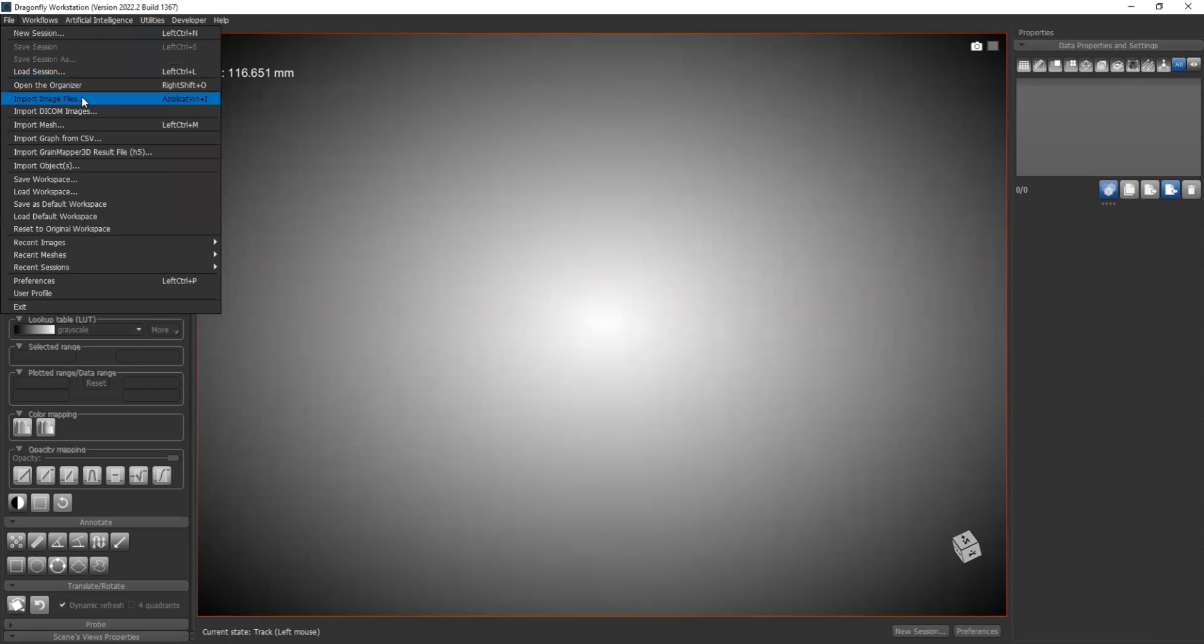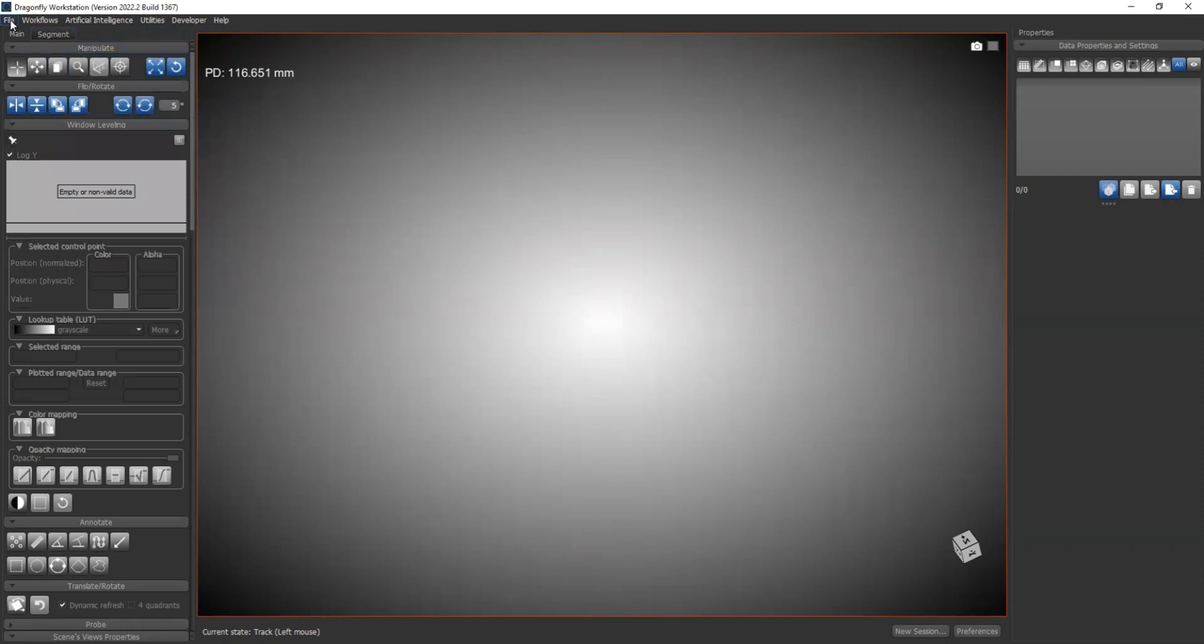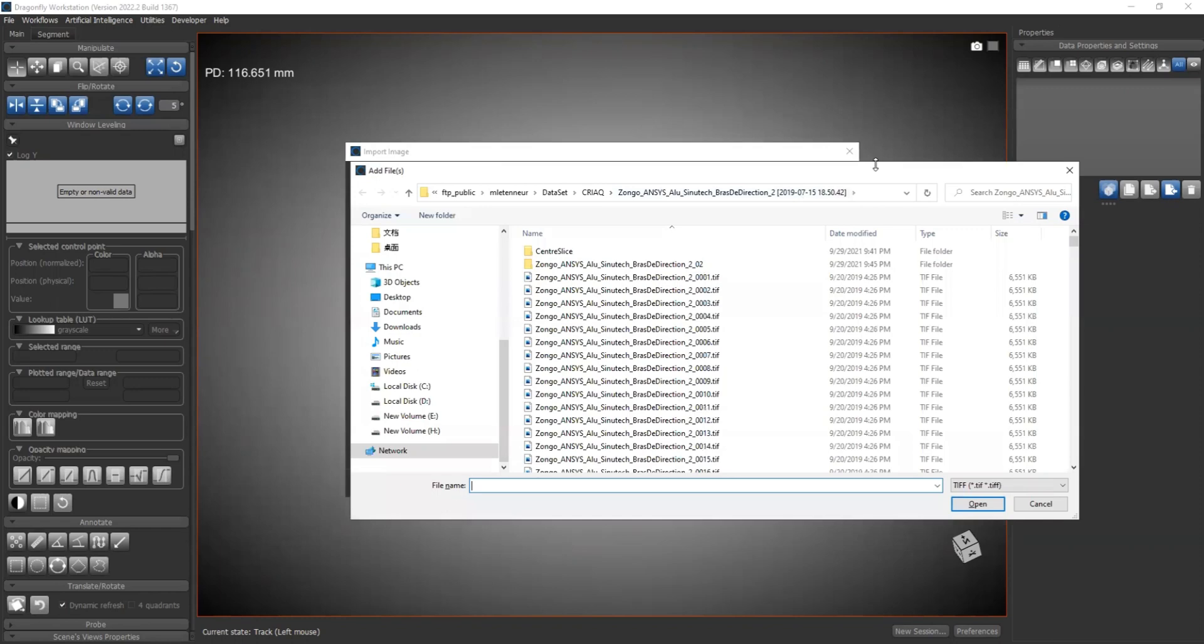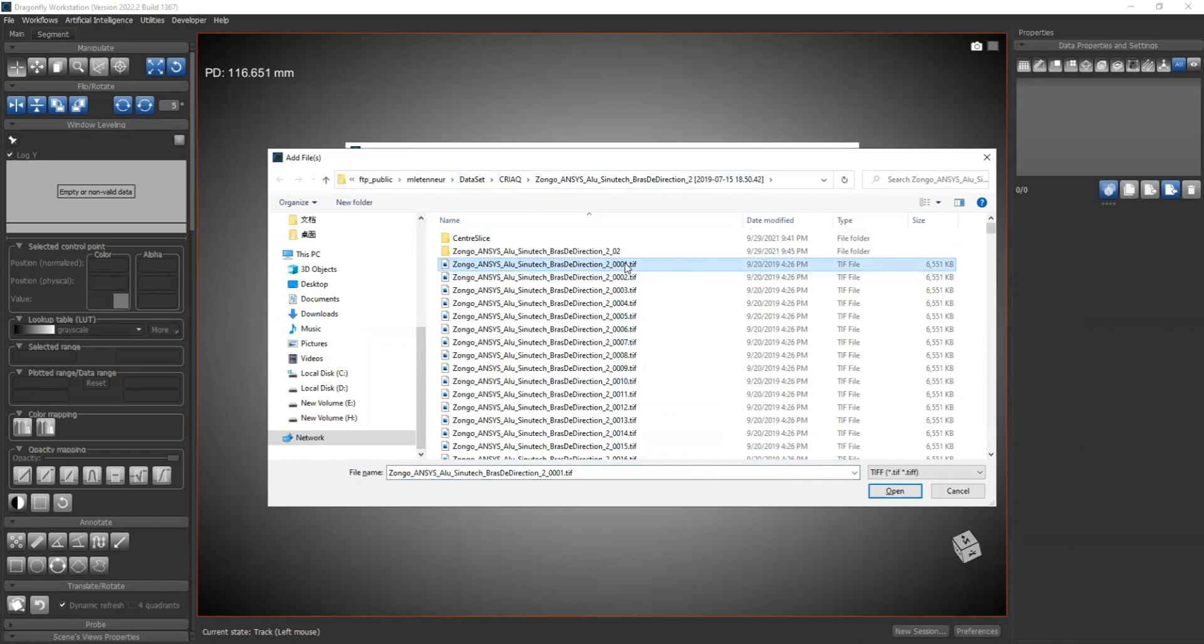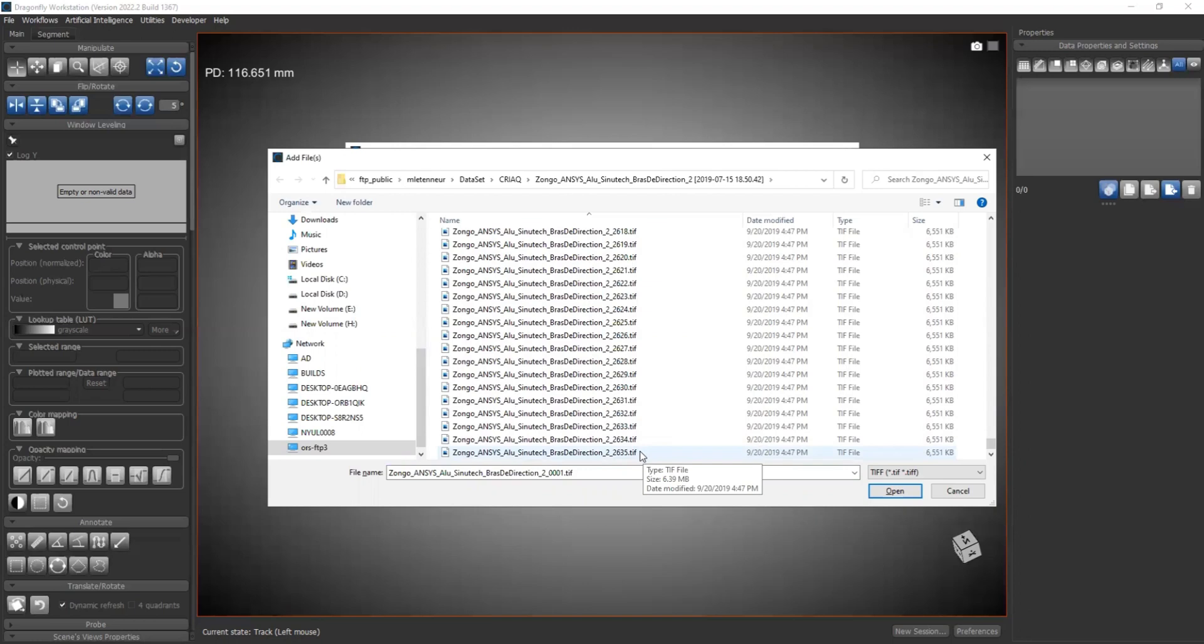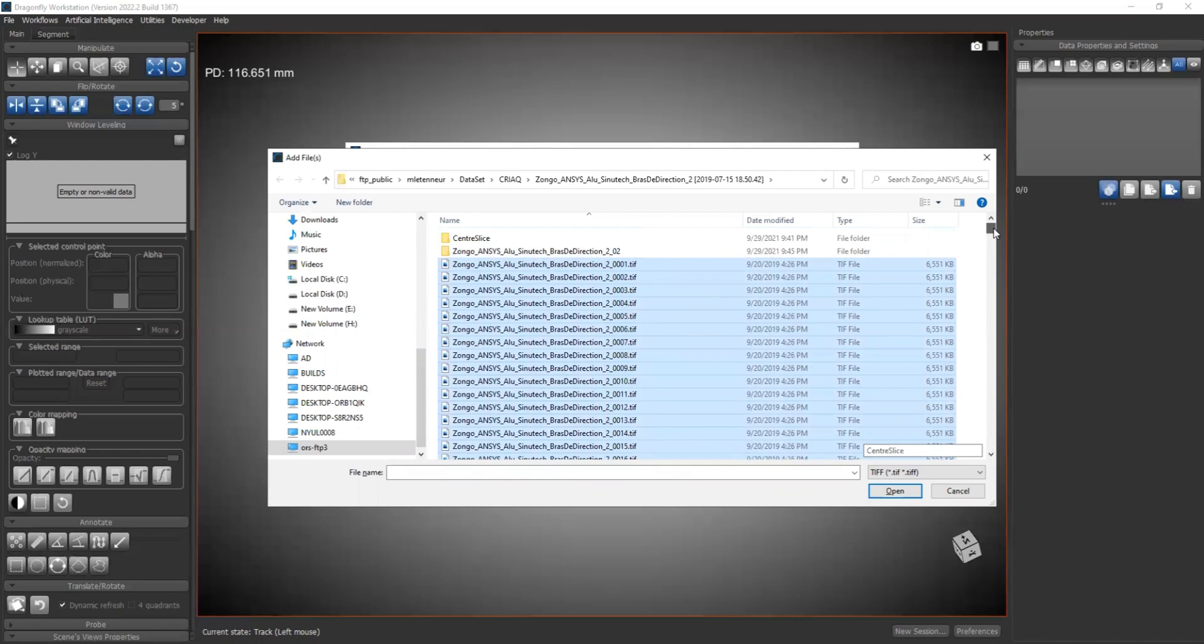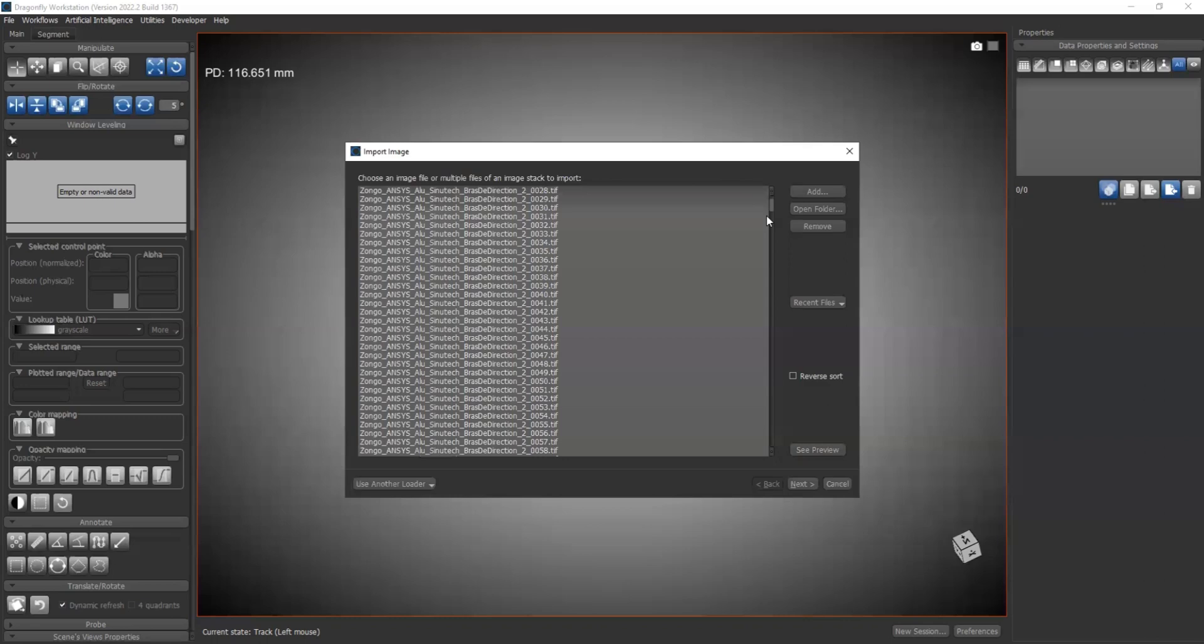For the first step, let's load the projection images. In Dragonfly, select file, import image files. Now you can open a folder or add images. We select add and go to our directories. You can see we have 0.0001 TIFF until 2635 TIFF. We can select all of those images. One of them represents one projection at a certain rotation angle. And say open.